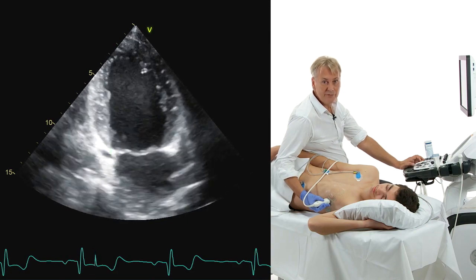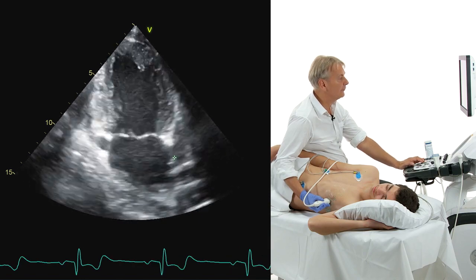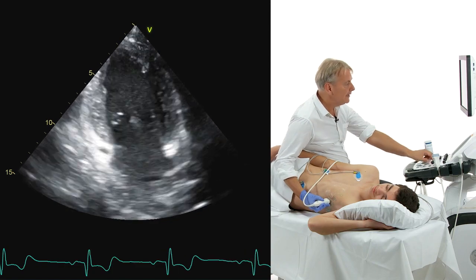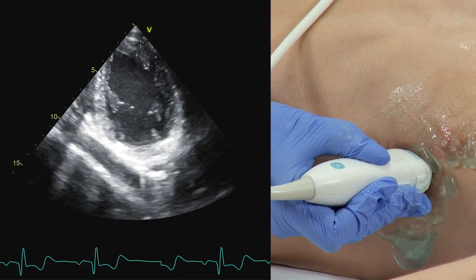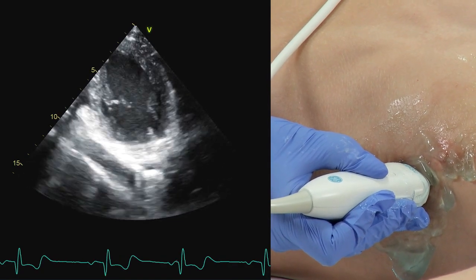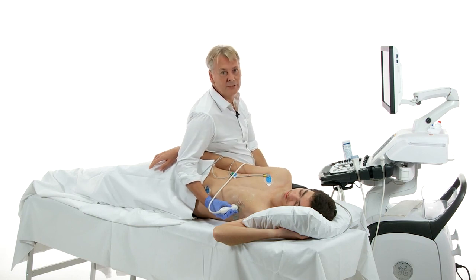A few other very important anatomic landmarks are the left atrial appendage that you will frequently see here in a two-chamber view, and the coronary sinus. With a little bit of tilt, you can sometimes also see the descending aorta. Let me display that. Tilting a little bit, often you lose the left atrium here. You have the descending aorta right here in your field of view. So, in essence, it's not difficult to find the two-chamber view if you adhere to these few tips.